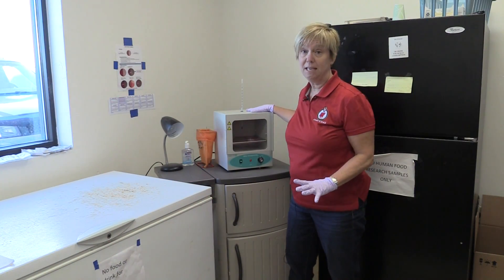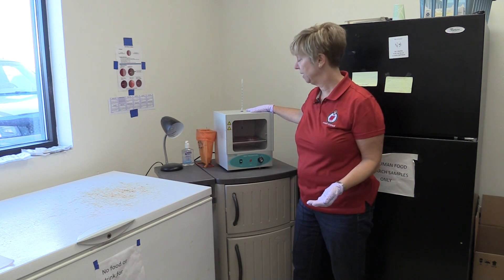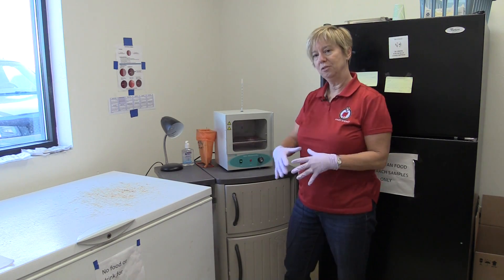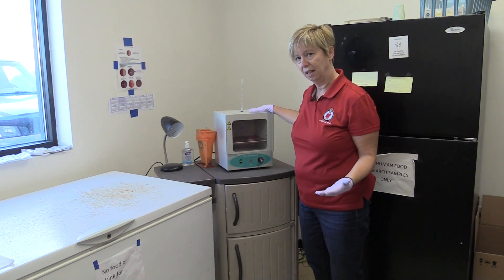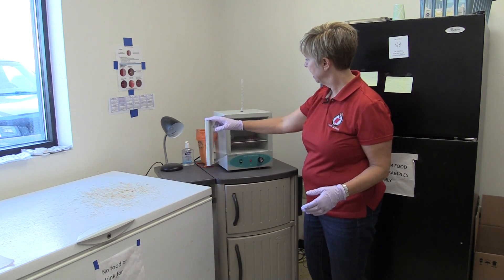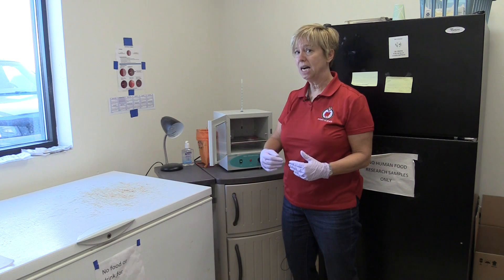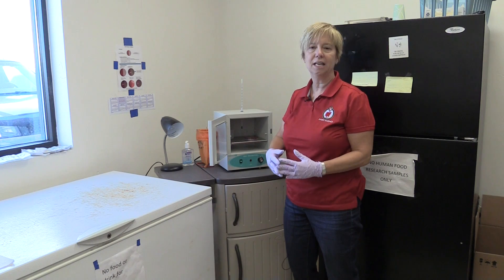Really one of the most key pieces of equipment when starting an on-farm culturing program is to have an appropriate incubator. I highly recommend buying one of these small incubators, such as this mini incubator, rather than using something like an egg incubator. These incubators are only a couple hundred dollars, they're easy to clean, and they can be kept at the proper temperature — approximately body temperature, about 98.6°F or about 37 to 38 degrees Celsius.